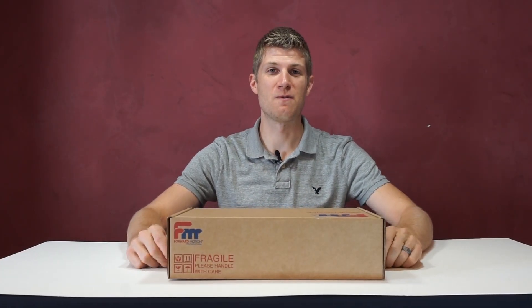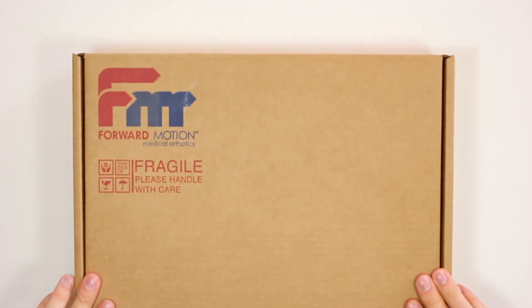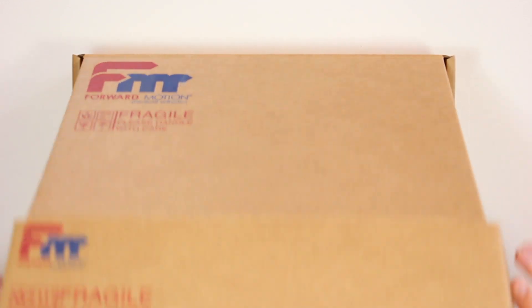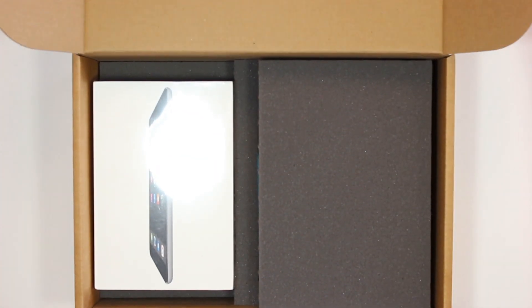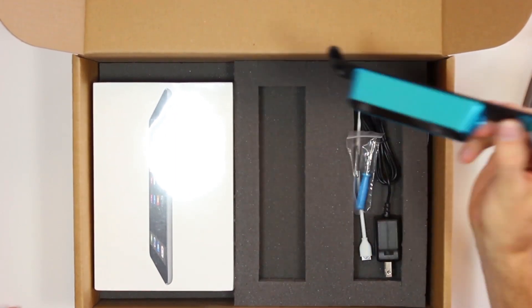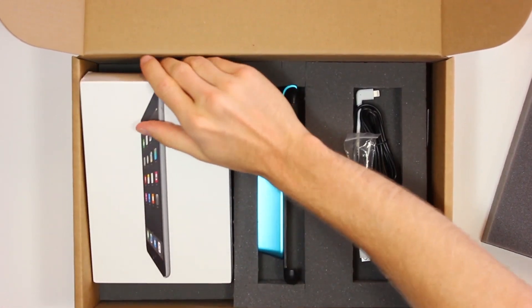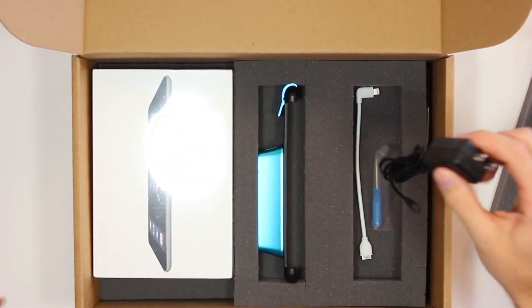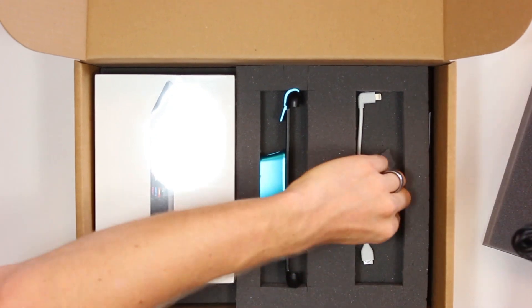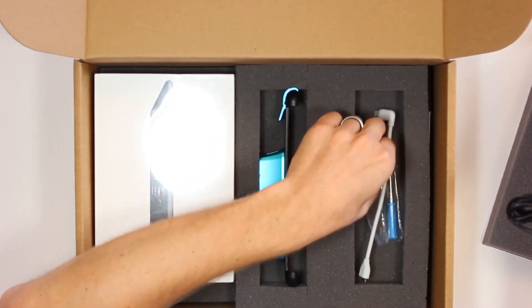Welcome to our unboxing video. We're going to be unboxing the 3D iPad scanner for Forward Motion Labs. When you get the scanner in the mail, it comes in a box like this. You have your structure scanner, a brand new iPad from Apple, the scanner charger, lightning cord, and screwdriver in case any of the screws on the back get loose.